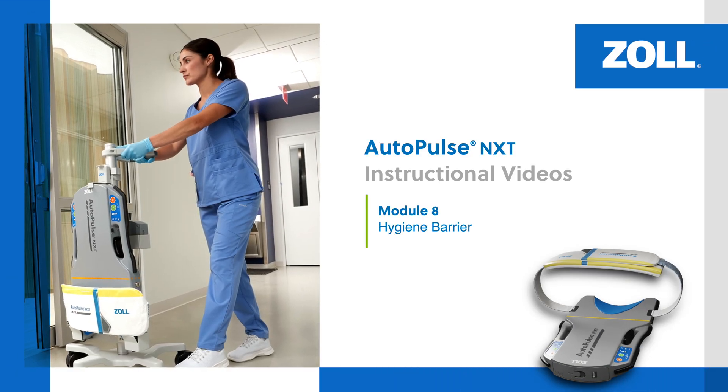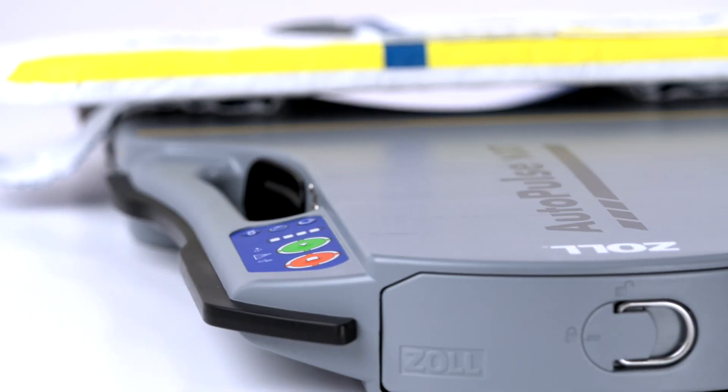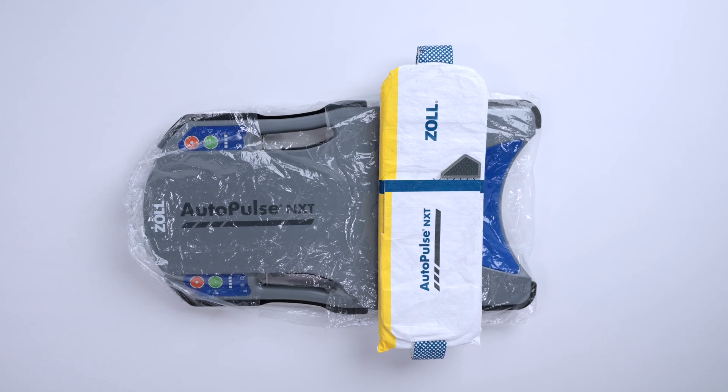In this overview, we will review how to apply and remove the hygiene barrier. The AutoPulse NXT Resuscitation System includes a hygiene barrier, or a plastic cover, to help reduce contamination during use.